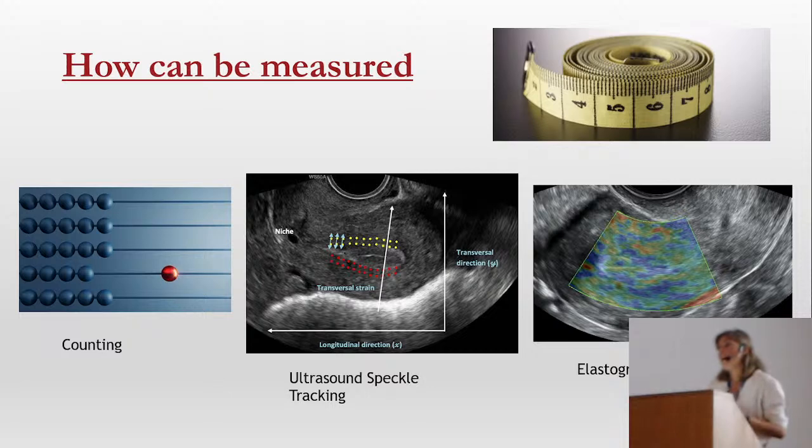I tried to work with them on my 4D ultrasound, but they couldn't, because it's too much information and it's more manual than automatic. Anyway, it's quite interesting, but I think we need more. And we have the technology now to do more.